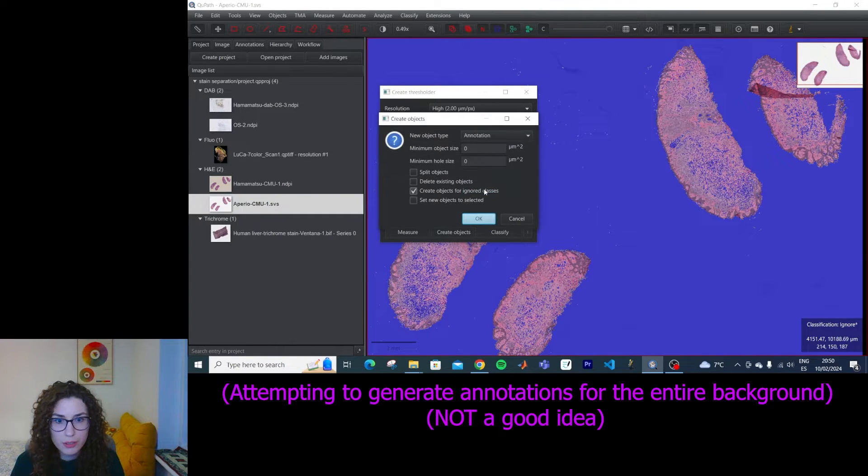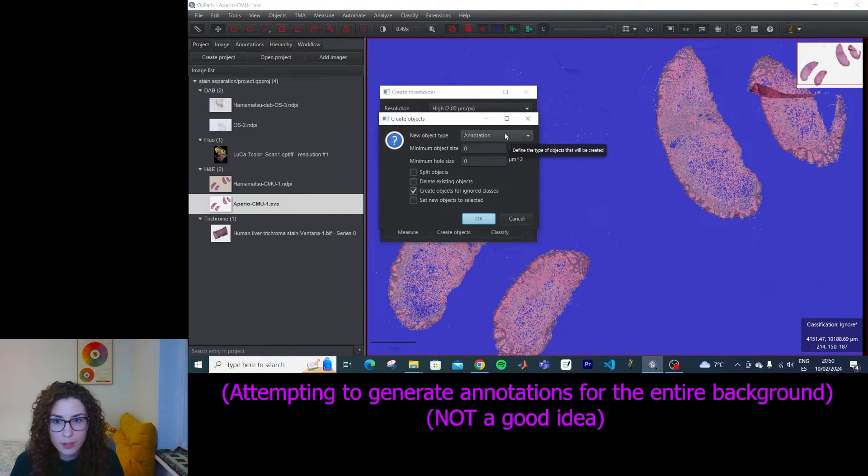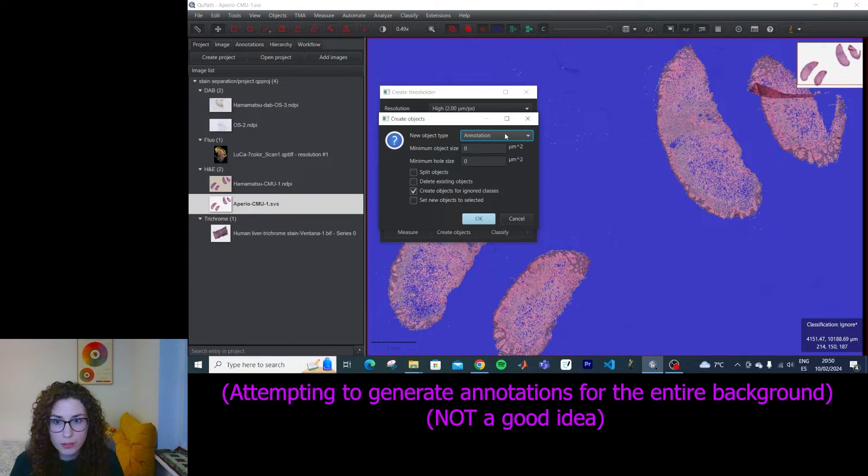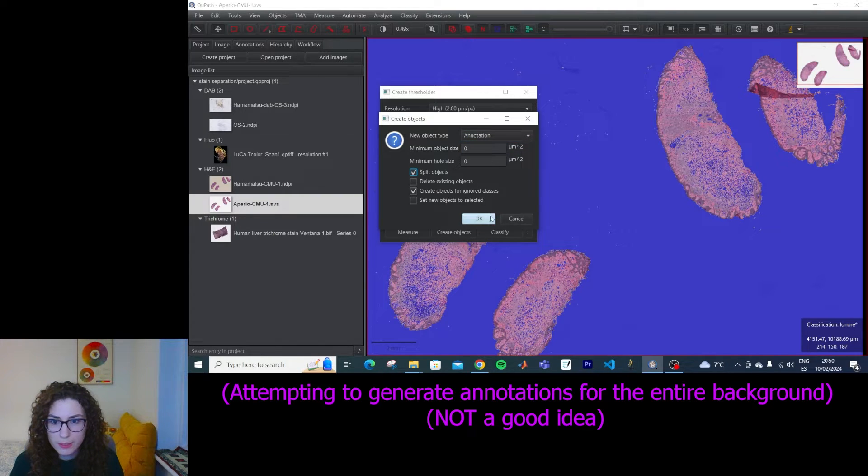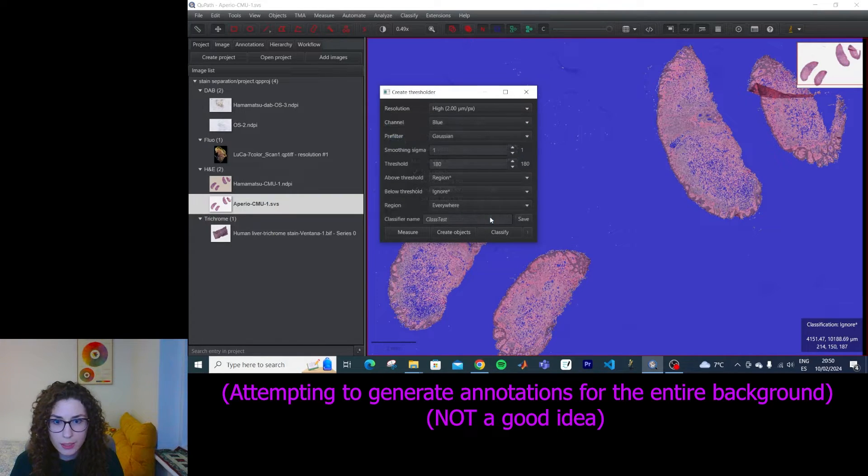Okay. Then I can click create objects. Full image. Okay. And I can split the objects.